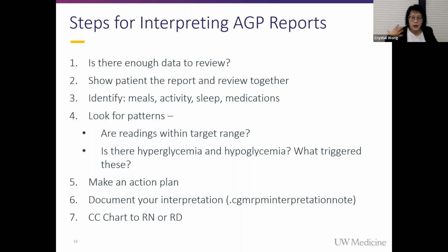And this is a similar frame of reference you have mentally if a patient is bringing in their old-fashioned chem sticks and you're looking at that, like, okay, when was this 250 from? Oh, you had just eaten ice cream, those types of analyses. And then you're going to look for patterns. Number one, is the patient just in their target range? If they are, awesome, you don't have to change anything. Are there areas of hyper and hypoglycemia, and what triggered those? And then you're going to make an action plan based on your analysis of the curves.